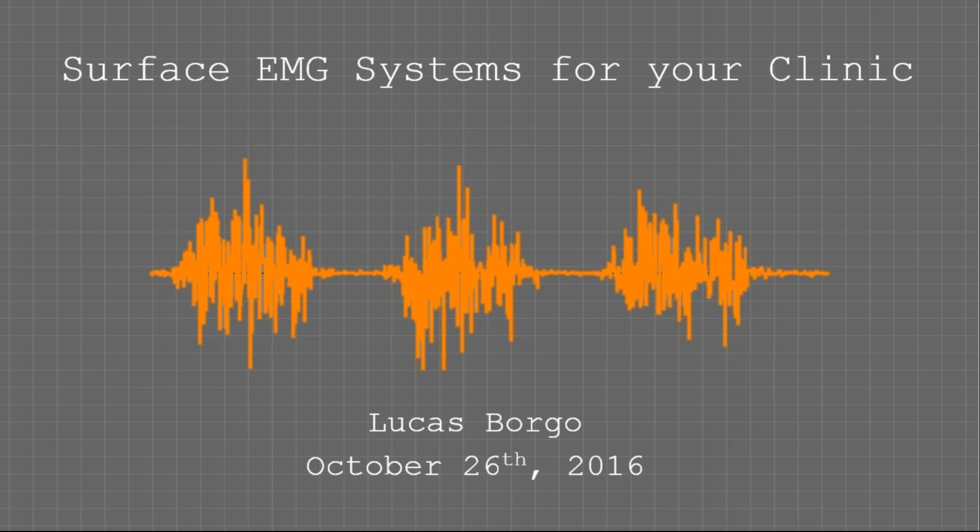We're going to spend about 25 minutes going through what we offer in terms of our software and our hardware, and how to get through some of the Thought Technology lingo and jargon that we sometimes get caught up in. We'll give you a guiding path on how to put together a system with us, and we can extrapolate that out to our entire systems, not just our EMG systems, though they do tend to get a little bit confusing from time to time, as we'll see.